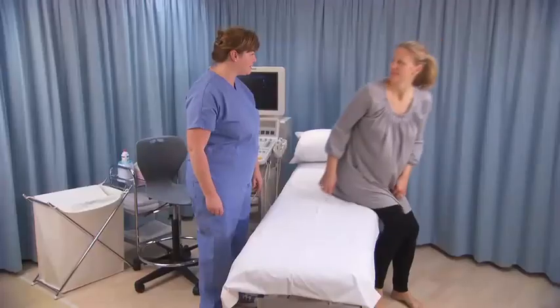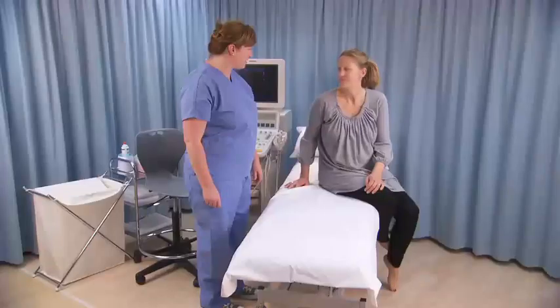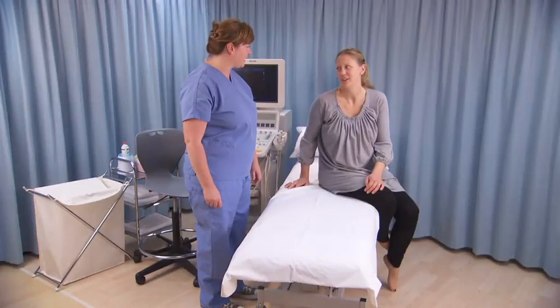Introduce yourself, explain the procedure, and obtain informed verbal consent. Ask the patient if she would like someone with her during the scan.